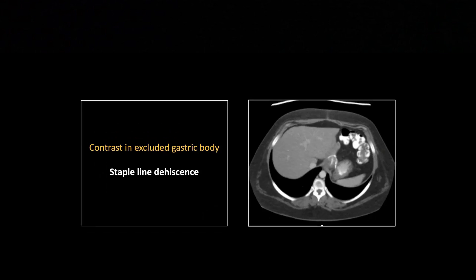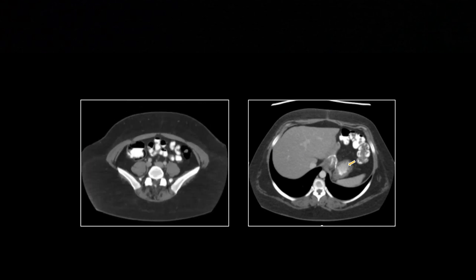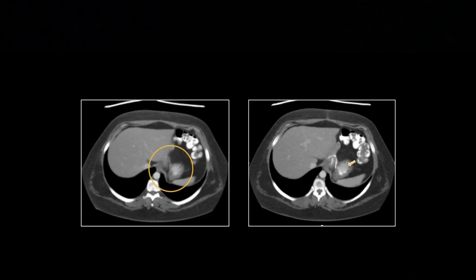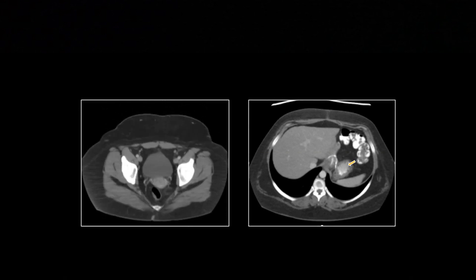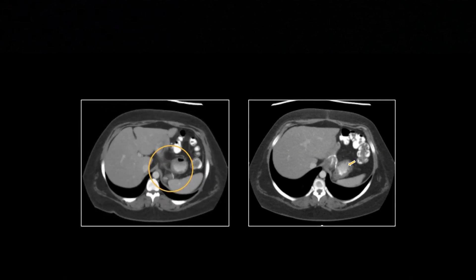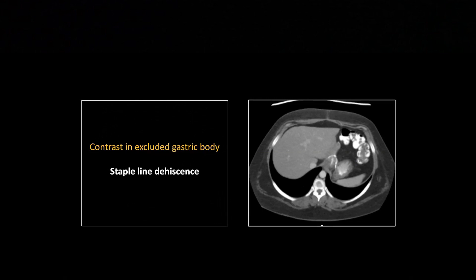This is a straightforward staple line dehiscence — a little more subtle because there's less contrast flowing into the native gut lumen. You can see the staple line and then contrast within the native gastric fundus where it should not be; it should go through the sequestered portion and flow straight into the efferent loop. Just a little contrast in that native stomach is sufficient to diagnose staple line dehiscence. It may not cause terrible problems immediately, but it suggests weakening of the staple line that may require revision.